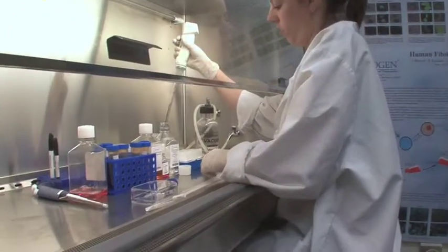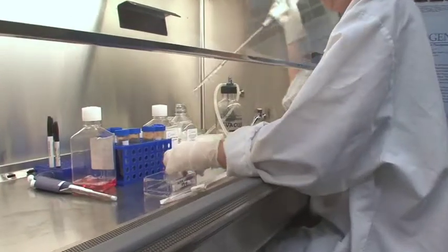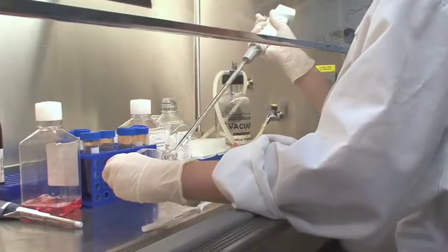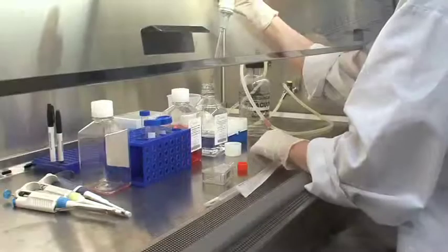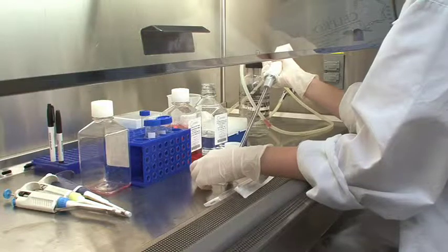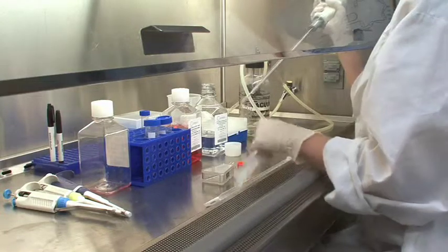Wash flask with 3 milliliters of the 1x PBS solution for 2 to 3 minutes. Remove and properly dispose of the 1x PBS solution. Note, in the T25 version of the protocol, wash with 2 milliliters of the 1x PBS solution.